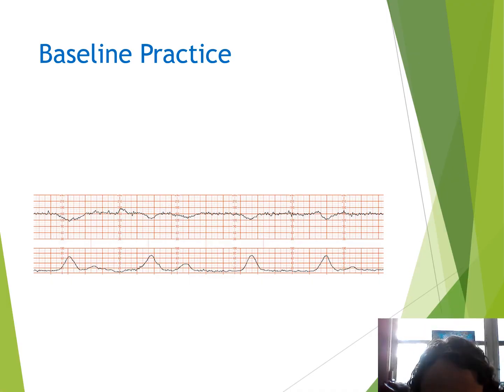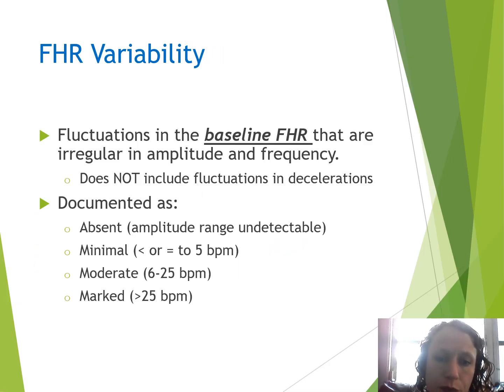So again, baseline practice. This is really hard for me to see. I want to say it might be 150, but I cannot see it very well on my screen. So you want to see where the majority of the line falls. That's the first step. That's the very first thing that we look at: baseline.